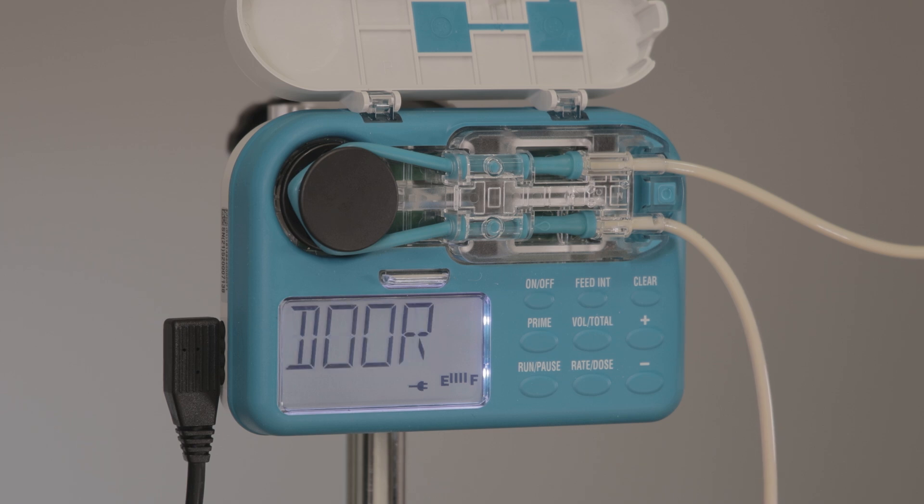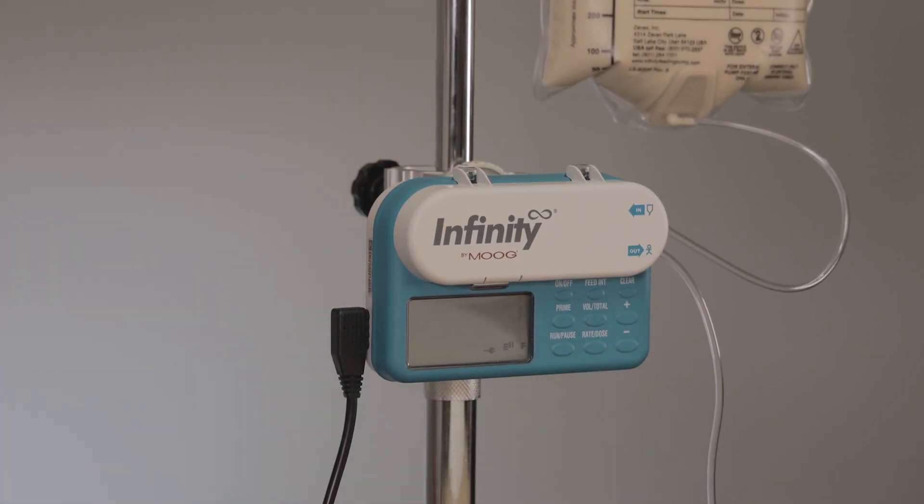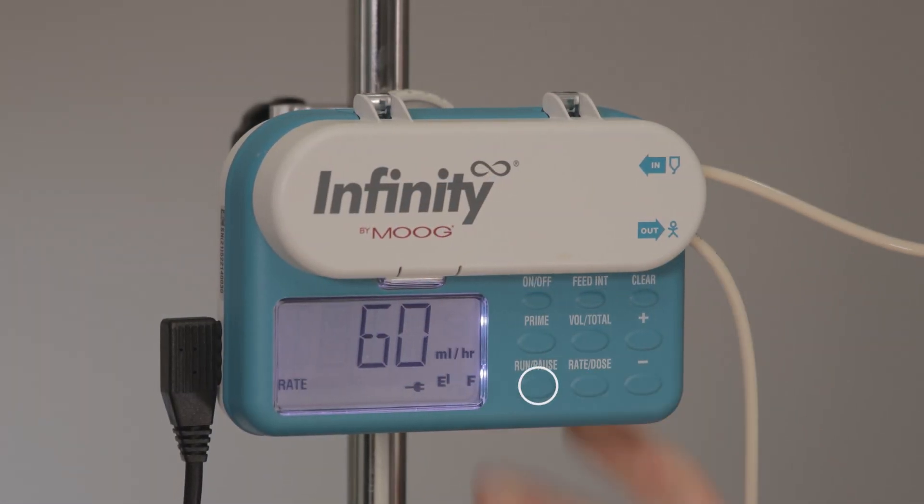In most cases the pump provides very simple two-word descriptions when an error occurs. A shut door alarm will occur because the pump door was opened while the pump was running. To silence the alarm, press the run pause button, shut the door, and press run pause to restart the pump.